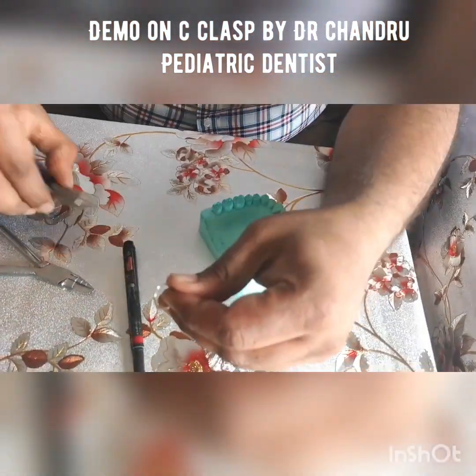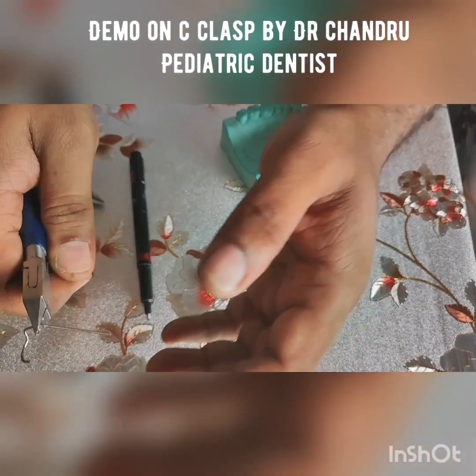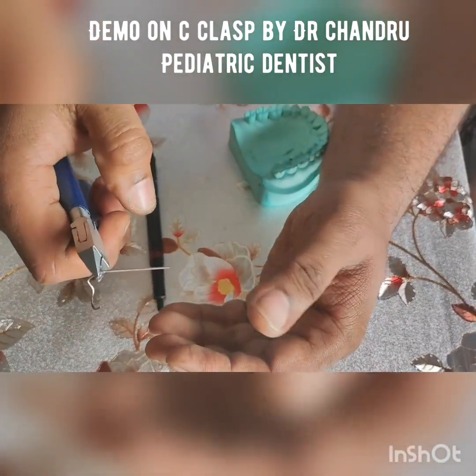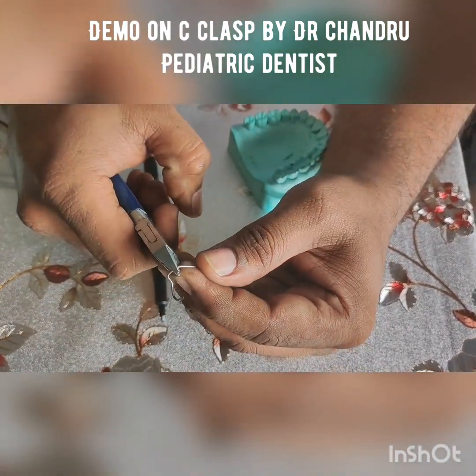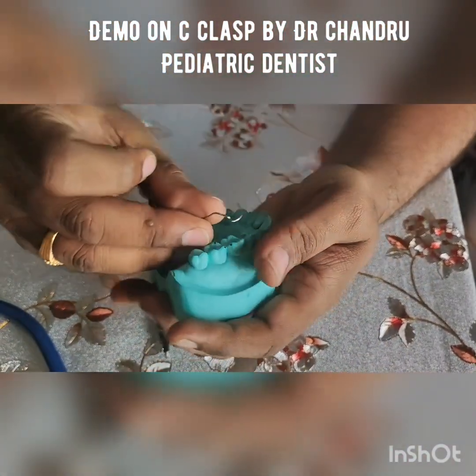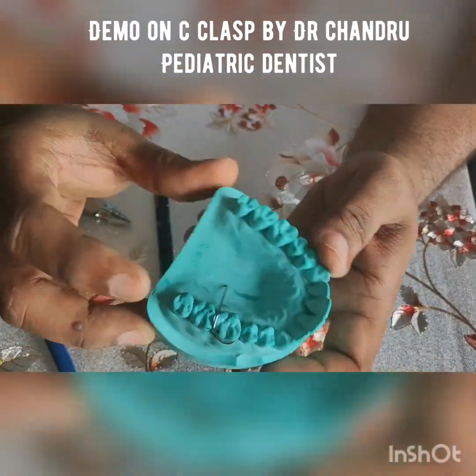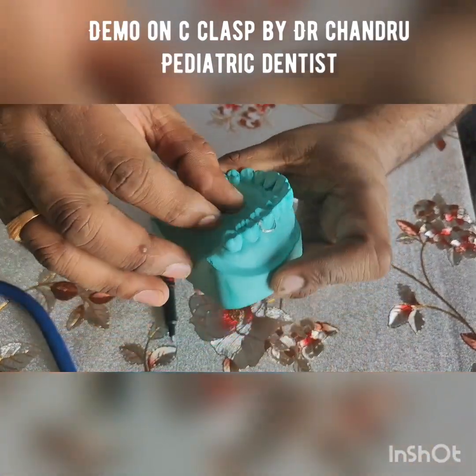So hold the wire to the point and to the same angulation that you kept on the cast. Similarly, give a downward bend in such a way that the whole adaptation of the wire takes place onto the palatal surface. You can see that.